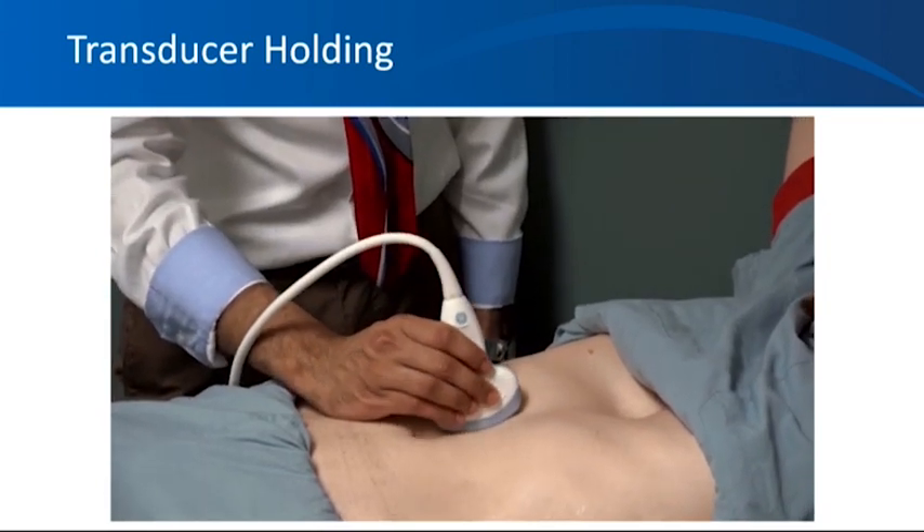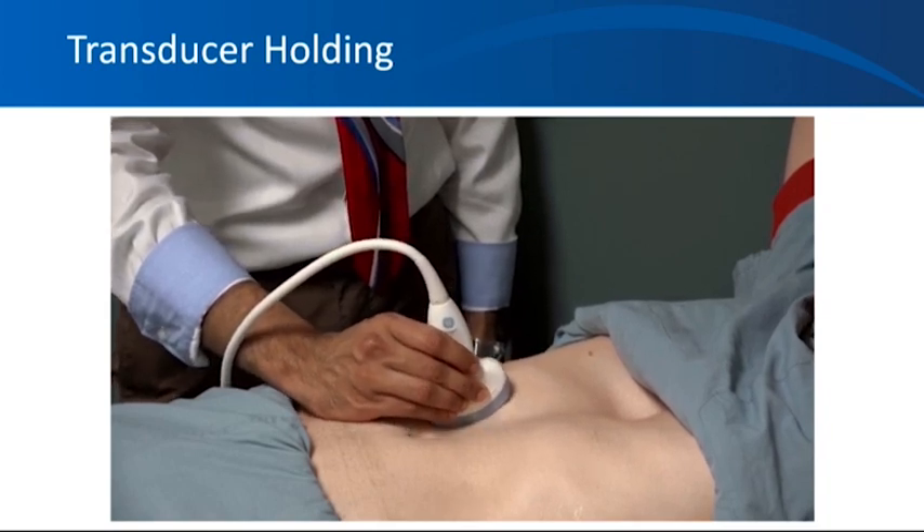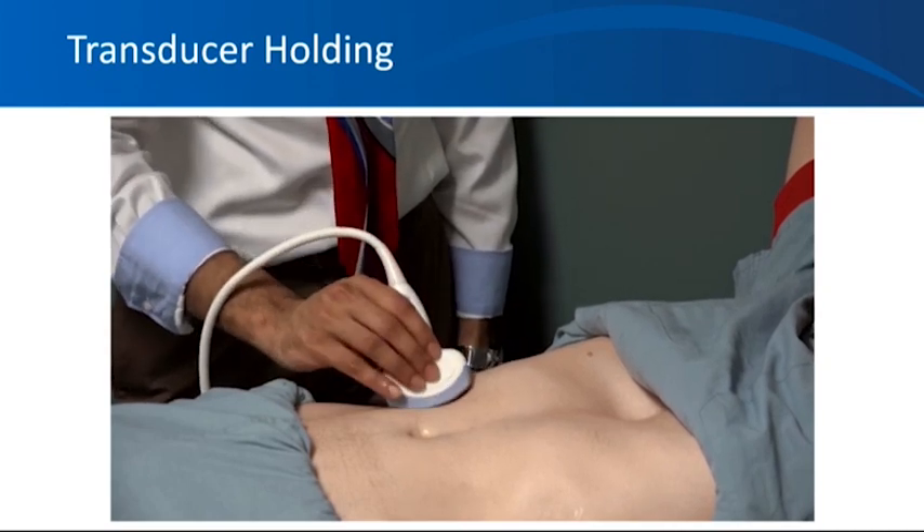However, it might not always be possible to do these, especially when you're standing by the bedside and the bed cannot be adjusted according to your height, or the patient cannot follow instructions — that sort of thing.